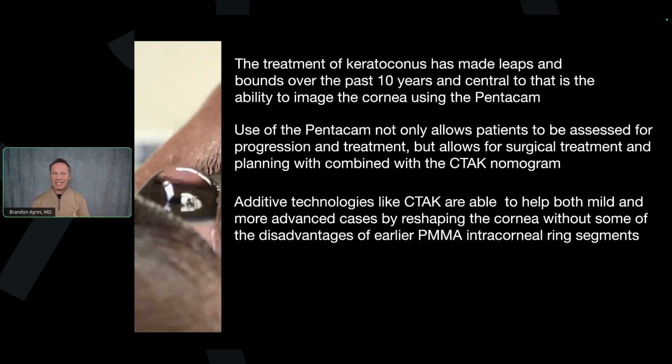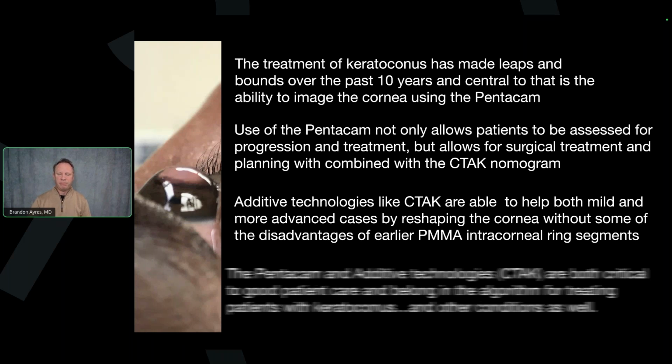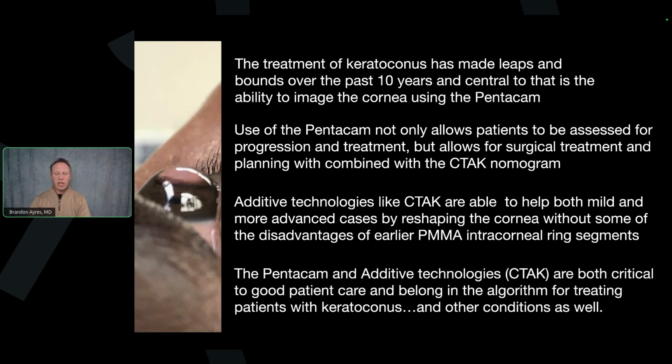I don't do Intacts anymore. I never will. I haven't done them in a while. It's CTAK, and that's it for me as far as additive technologies. And the Pentacam and these technologies are really critical at taking good care of patients with keratoconus.